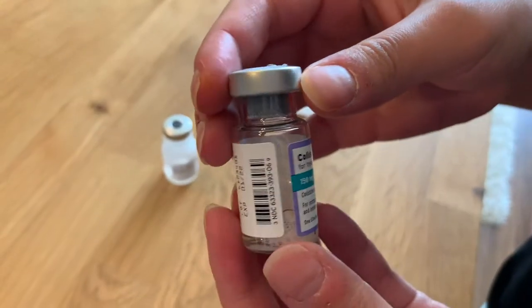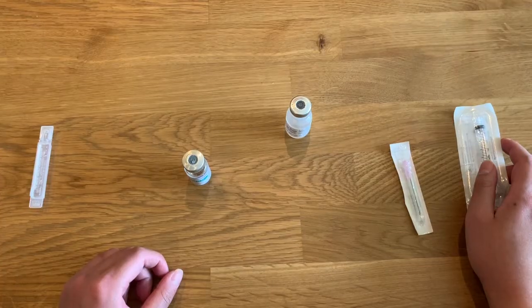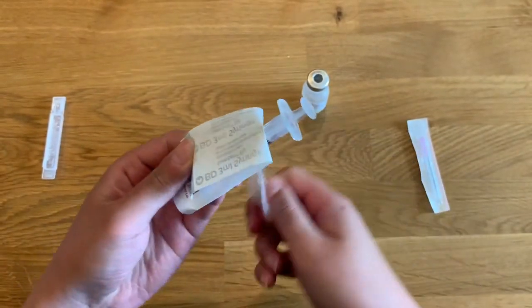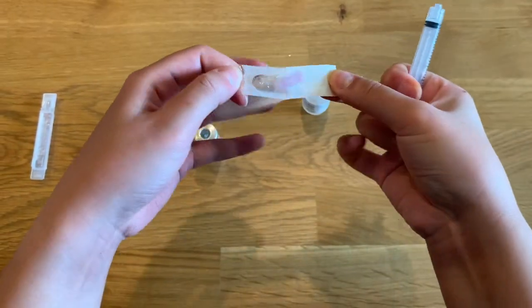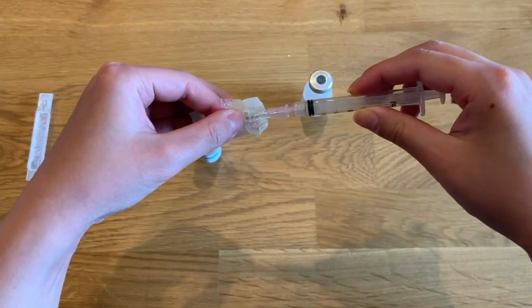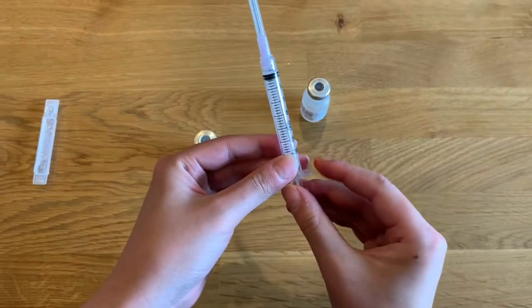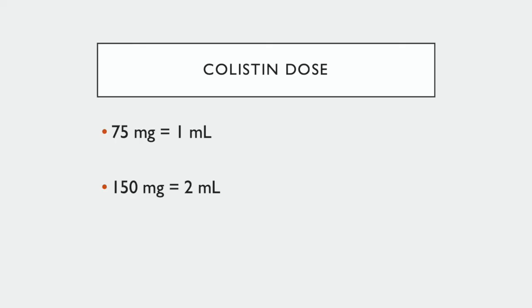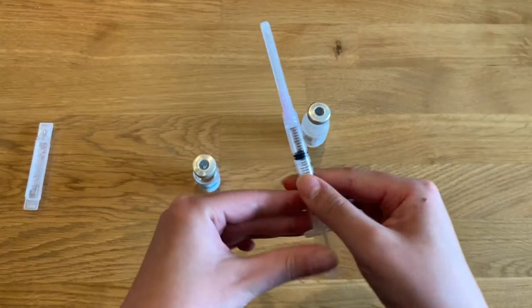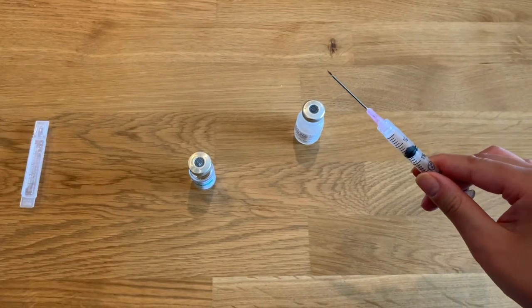Now that the colistin vial is mixed appropriately, you are ready to draw up your dose. Remove a 3 milliliter syringe from its package and manipulate the plunger up and down to ensure it is working appropriately. Attach one of your hypodermic safety needles. Pull the plunger back 1 or 2 milliliters depending on your dose: if your dose is 75 milligrams, pull back 1 milliliter; if your dose is 150 milligrams, pull back 2 milliliters. Then swiftly pull off the protective cover from the needle.